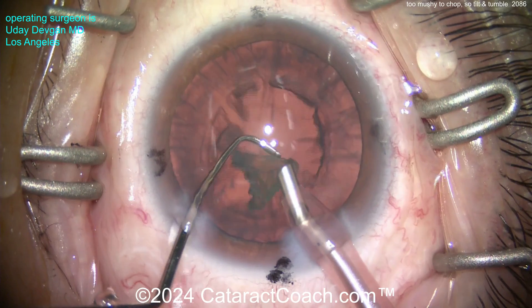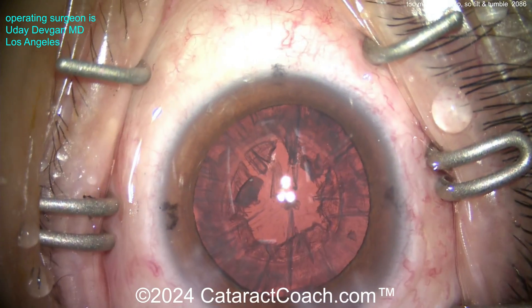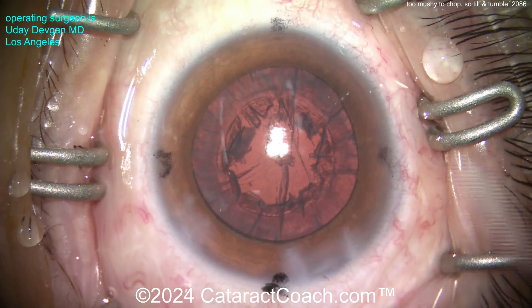You can see it makes short work of this nucleus. This technique is meant for a softer nucleus, not necessarily a very dense one. For a denser cataract I would have preferred to tilt it out of the bag and then chop it. Now we switch over to the IA probe and go from there.